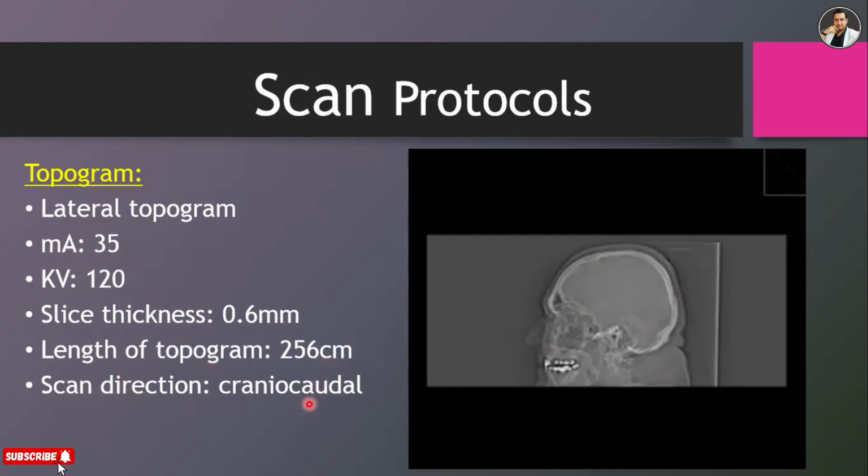The scan direction will be craniocaudal, which means head to foot. The scan starts from the vertex to the neck, so the centering will be over the head.